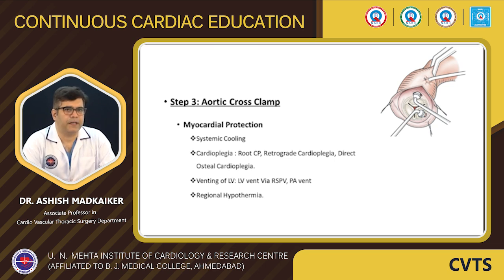There are various techniques by which we can give cardioplegia. We can give cardioplegia into the aortic root through an antegrade approach, or we can give it through the coronary sinus through a retrograde approach, or we can open the aorta and give it by a direct ostial approach.